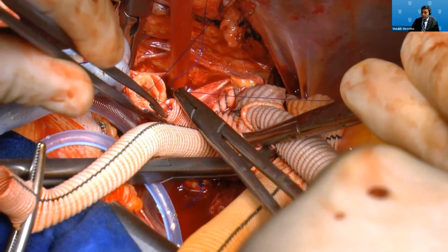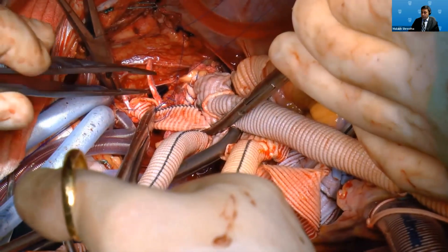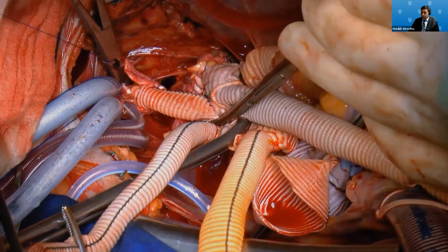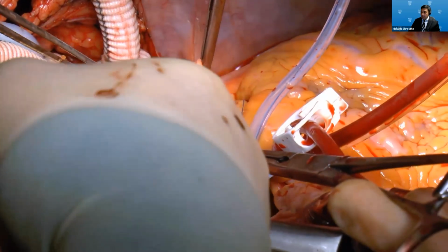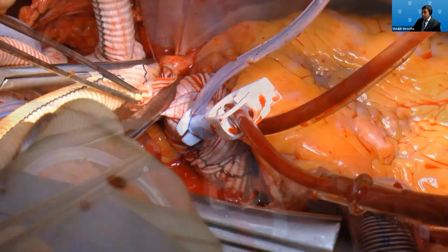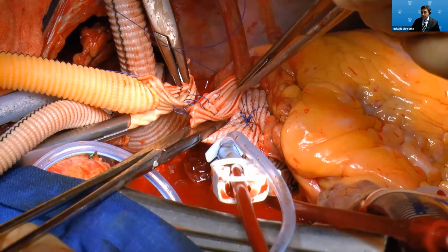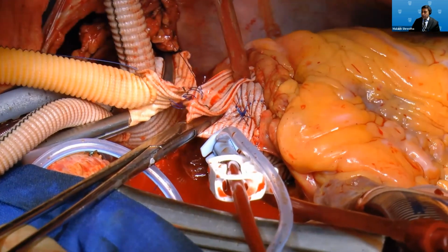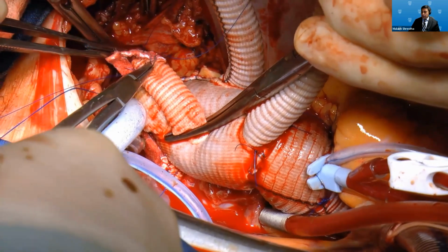Over the years, I think we've done now more than 400, almost 500 Thoraflex implants in Hanover. I personally did maybe more than 300 here. So in these cases, over the years, we've learned a lot. You can see that the heart is beating even at around 25 degrees. So the biggest positive thing about this technique is that we don't have to worry about the ischemia time of the myocardium.